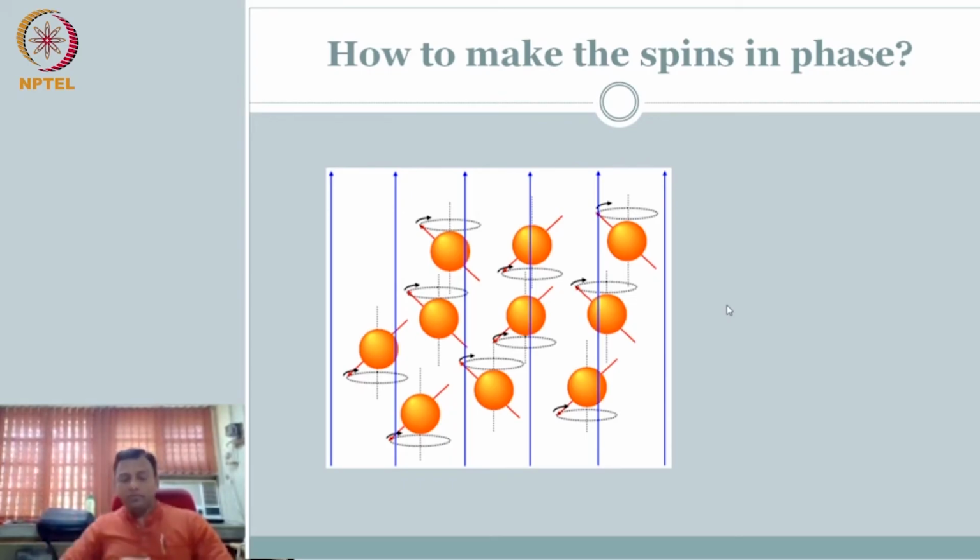We can make this happen if I can communicate, that is, create another magnetic field that can have influence on this spinning at the same frequency, right? Relate this to your regular forces, the gravitational field.